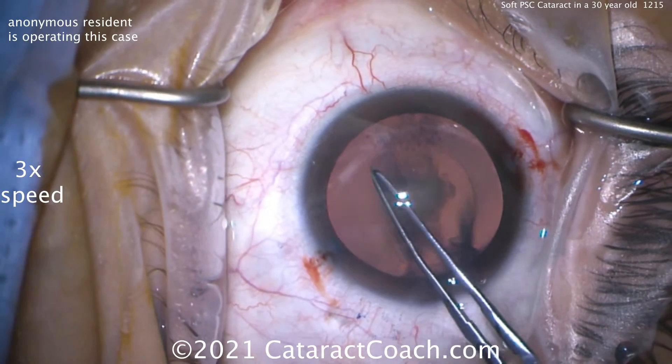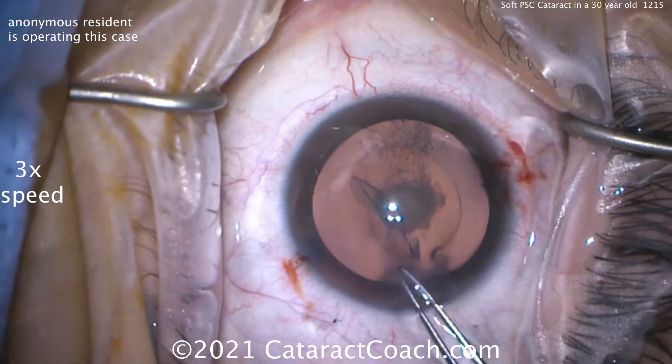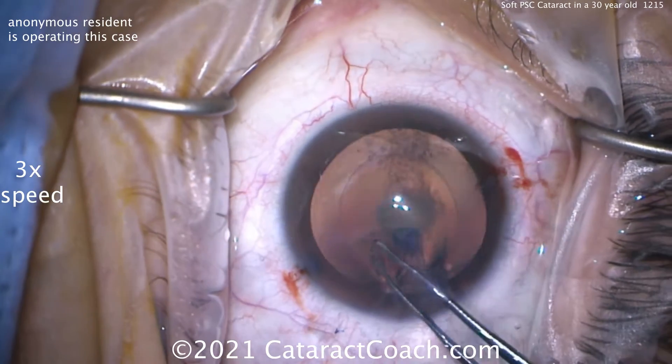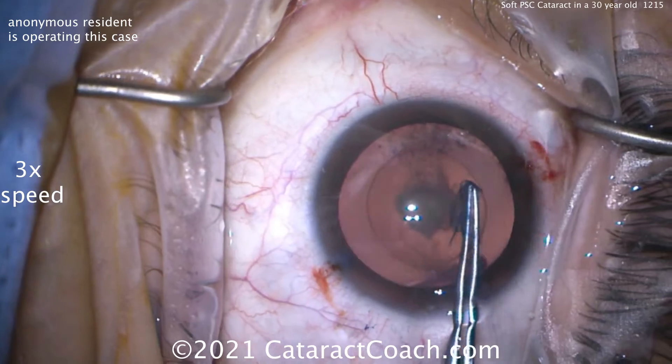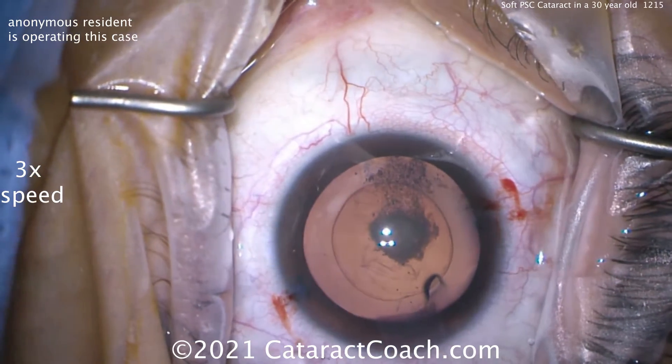In a case like this, I aimed on the smaller side, so it's getting a little bit larger, but I think we're still in that good zone. It's okay to re-grab it. Take your time. Change the angle if you need to. You might think that's too small of a rhexis, but actually that's just about perfect — I bet that's about 5.5 millimeters in diameter.